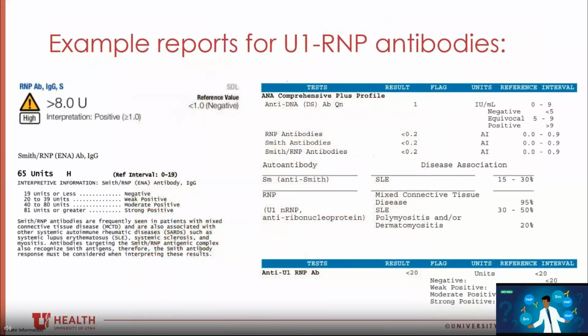Naming of assays for detecting anti-RNP antibodies based on the source and/or combination of antigens included in the assay is not consistent. In recent years, there have been efforts to label assays that use the intact U1 RNP complex as Sm/RNP or RNP/SM, and those that only contain the U1 RNP specific proteins or peptides as RNP.